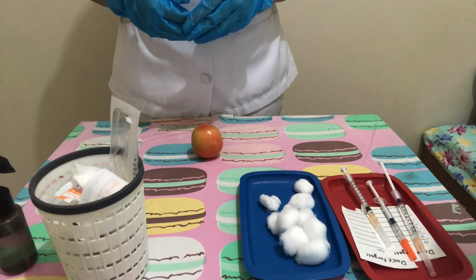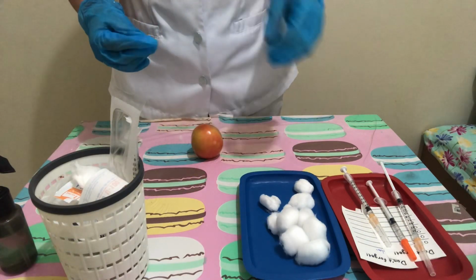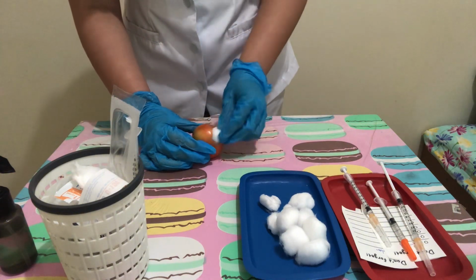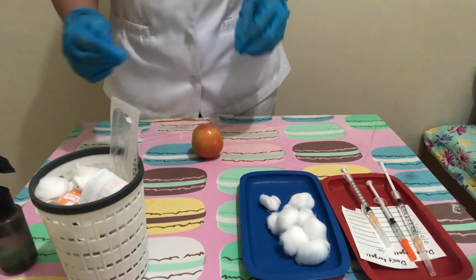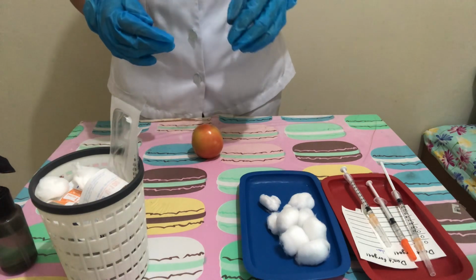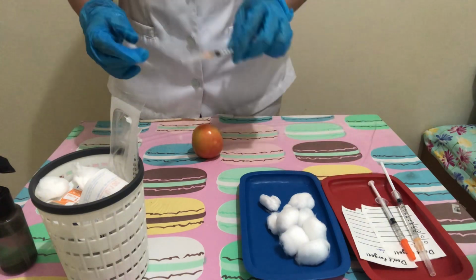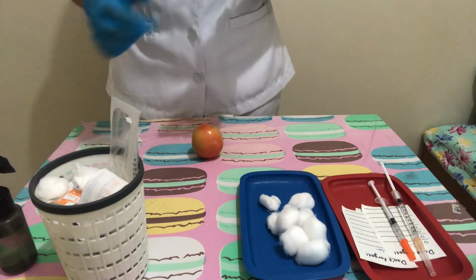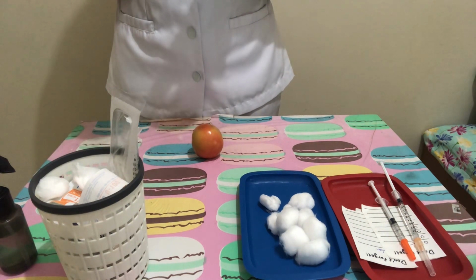Now cleanse the skin at the site using a firm circular motion. And then remove the needle cap while waiting for the antiseptic to dry, and expel any air bubble from the syringe.